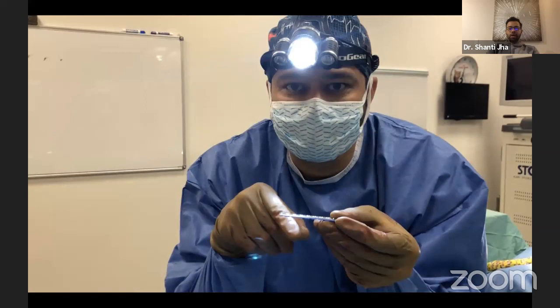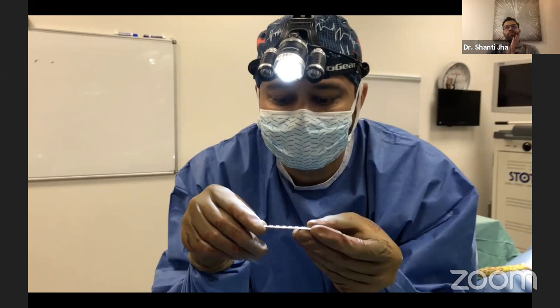I think this clipping is the most important of all the video clippings I showed you here. Pre-stressing for a radius ulna fracture is needed. The reason is that if you just put a flat straight plate, as you tighten the screws the transcortex will open up like a wedge. If you pre-stress it, both fragments move a little more towards the plate, and as they move, they come closer. So the cis and transcortex come together very well. So it's important to pre-stress.